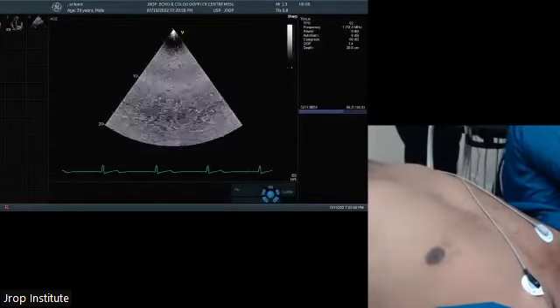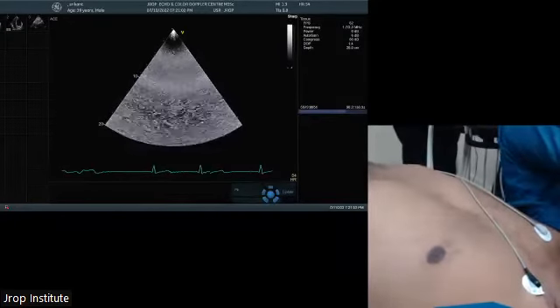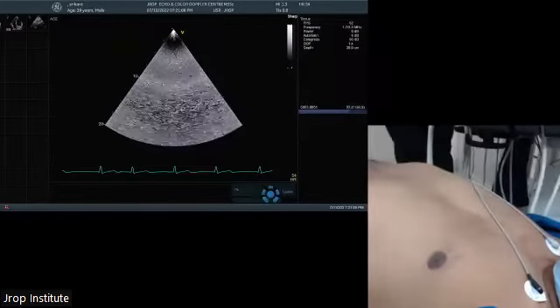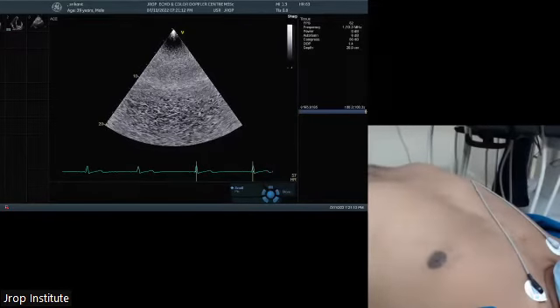Okay, sir. And similarly, in effusions, they report in multiple views, I think, lateral to LV, posterior to LV, and anterior to RV. Unfortunately, echo is not a very good modality for pericardial effusion, because pericardial effusion could be generalized or could be localized.